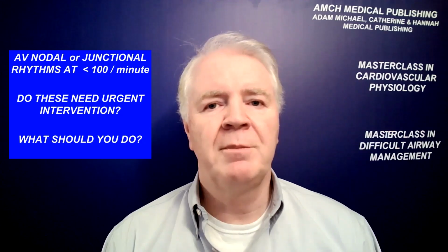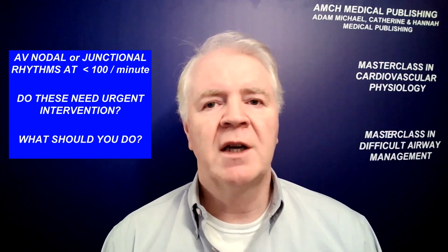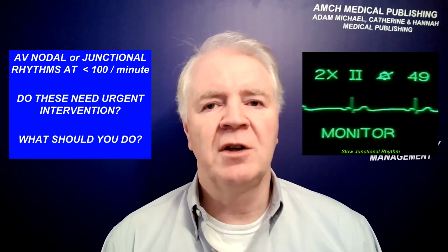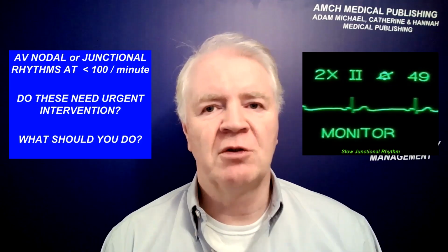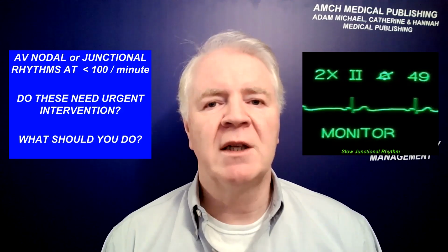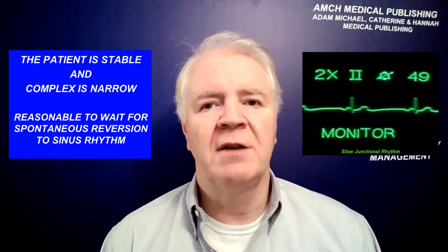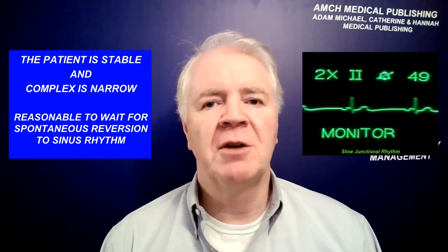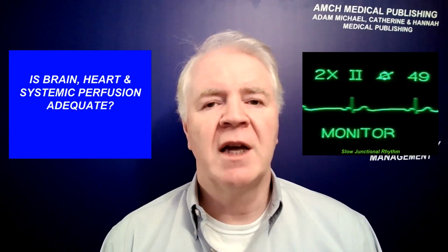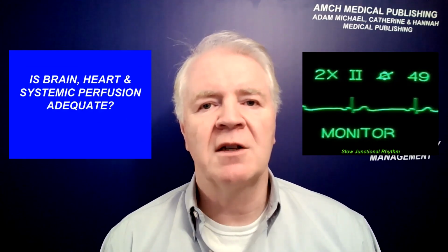Now let's talk about the appearance of AV nodal rhythms and junctional arrhythmias. The occasional junctional ectopic is usually of little significance. For the patient who is established in junctional rhythm at less than 100 beats per minute, however, we must evaluate this arrhythmia carefully. If the rhythm is stable, if QRS morphology is normal, that is, if it's narrow, if peripheral perfusion and blood pressure are satisfactory, then there is no urgency. The patient may soon spontaneously revert to sinus rhythm.